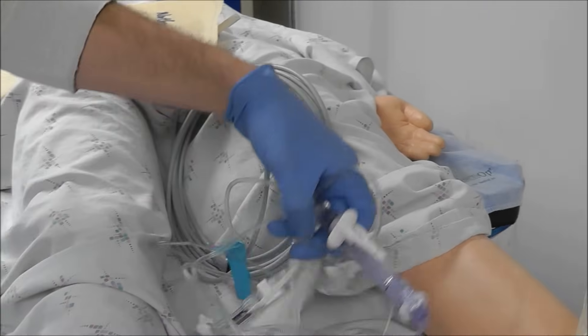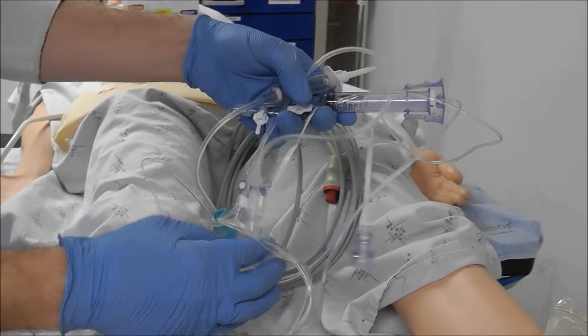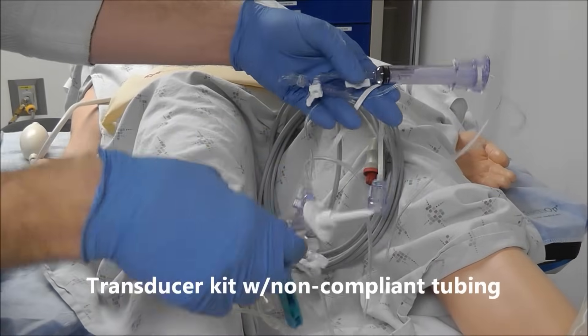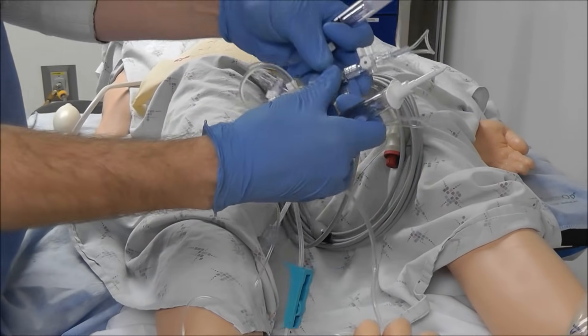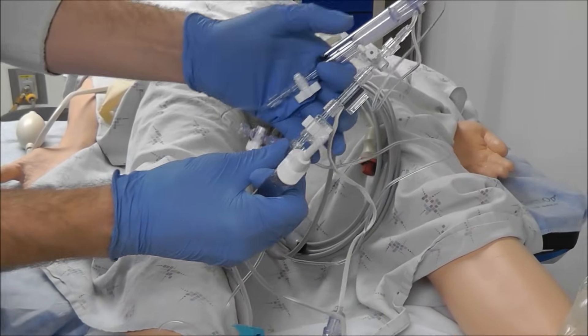The next thing that you're going to need in setting up an arterial line is the actual transducer that is connected to non-compliant tubing. So that's number two.